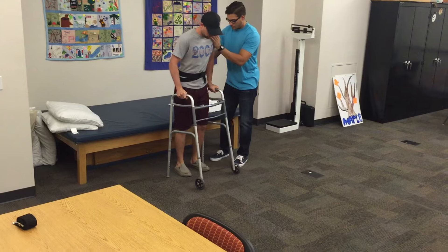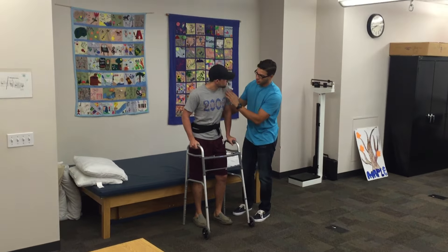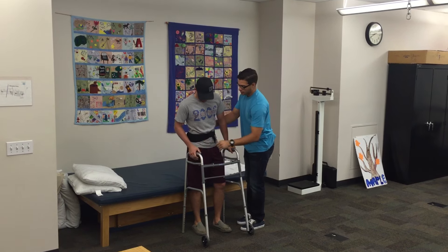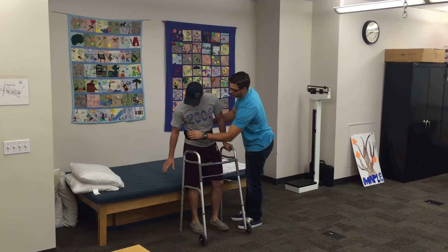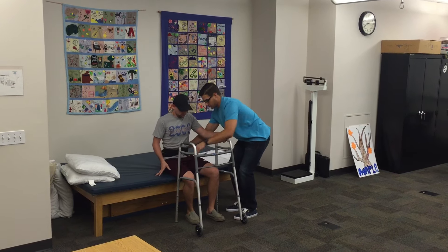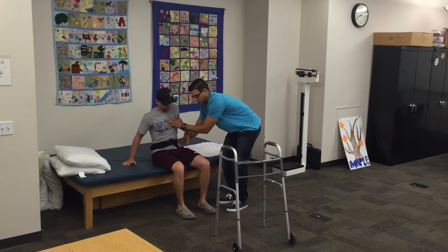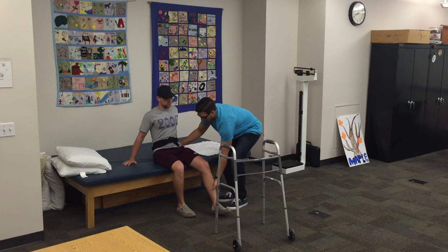Now we're going to take one step back until you can feel that there. Okay. Now what I want you to do is put your weight towards your right, towards that hand there. When you sit down — there we go. I'm going to help you on the count of three. There we go. All right, still feeling okay? Yeah. I want you to come towards you so you're not at 90 here. Perfect.